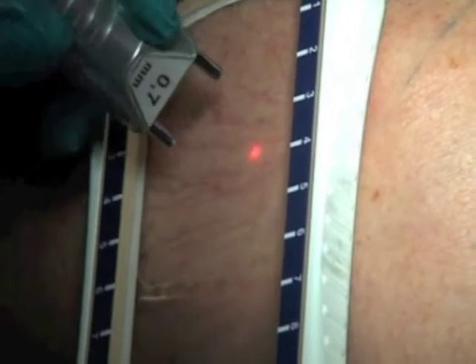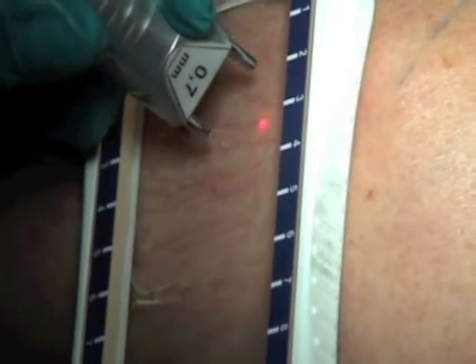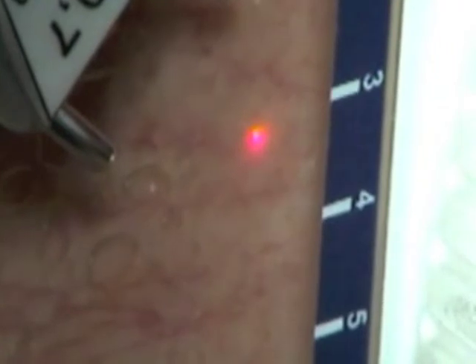Four points, and you really have to see that the point is focused on the skin and not on another point — that's very important. If you are doing it like that, you can see nicely the vessel going, and there is no problem. If you are working like that, you will have no results.